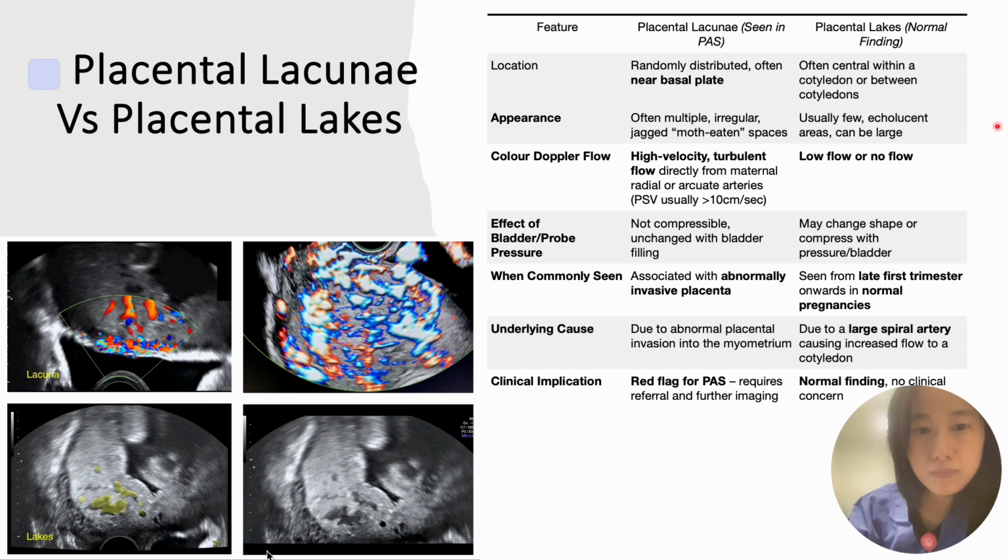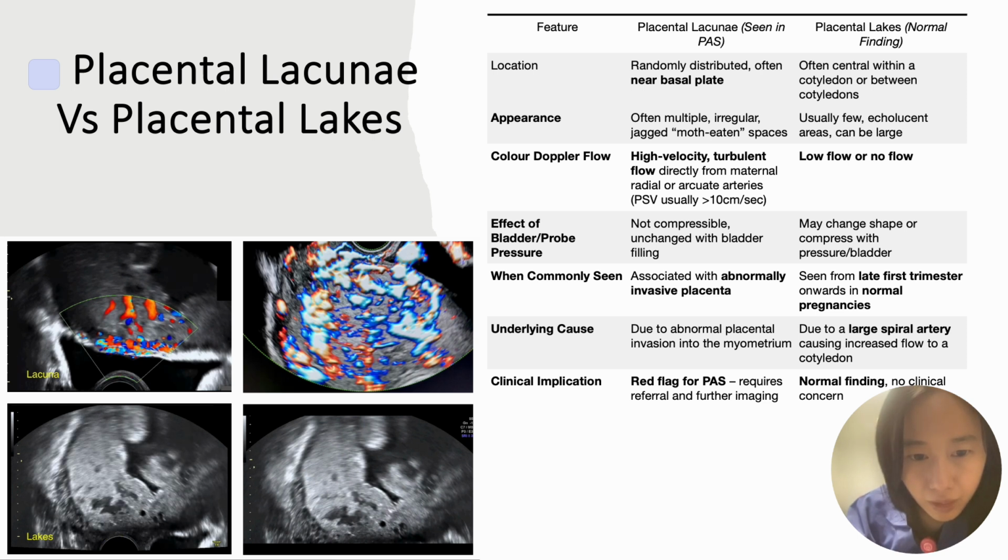Next one, placental lacunae versus placental lakes. It's quite interesting. I'll start with a little bit of video. Can you see here? These are the placental legs.